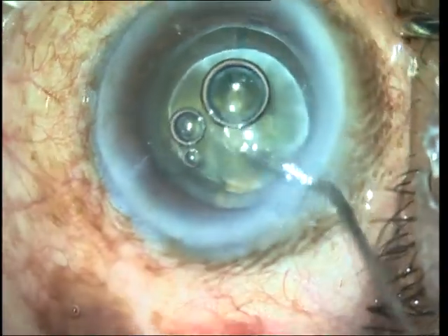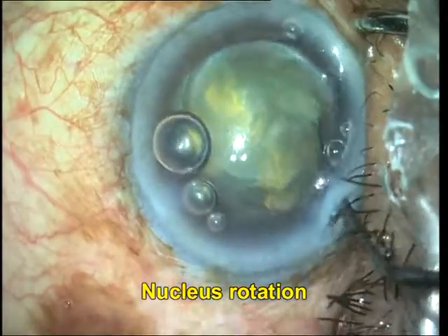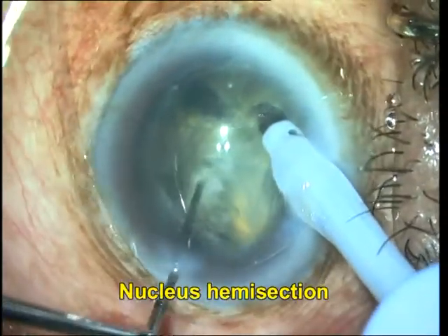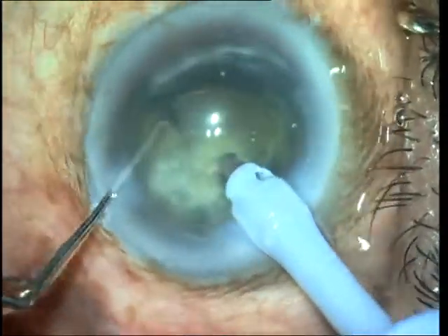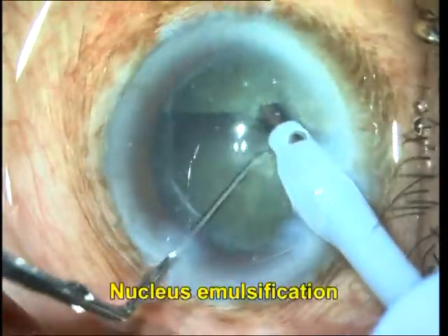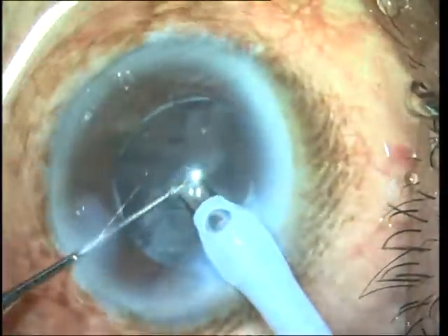Hydrodissection is then done and the nucleus is rotated. We already have the nucleus fragmented, and therefore the hemisection of the nucleus becomes much easier with the phaco probe. These segments are then brought out and emulsified one after the other.